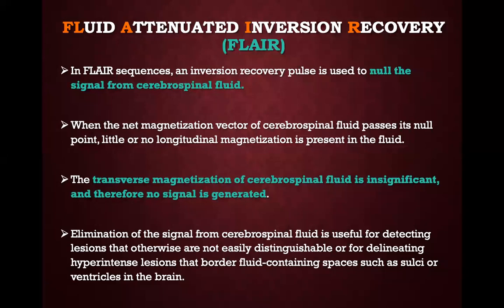This is what is important. This is what we all have heard of. FLAIR, fluid attenuated inversion recovery. In fluid attenuated, you basically nullify the signal that is coming from the CSF.